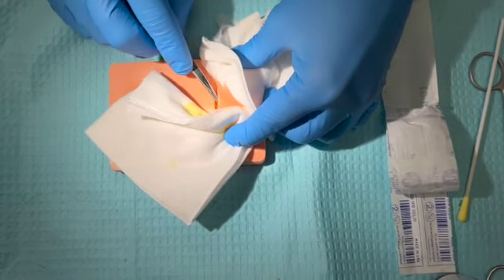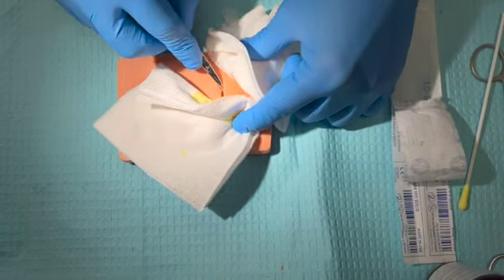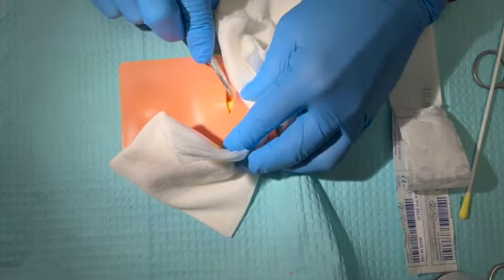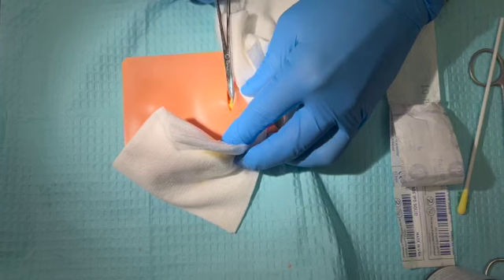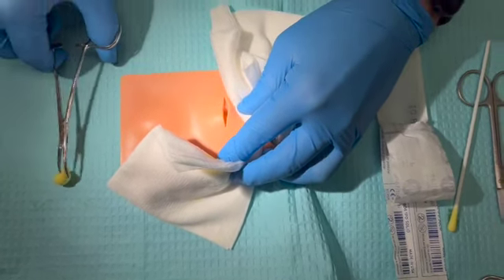We don't want to put our fingers in there for concern of potential sharp foreign objects that may be in relation to this. We can see in this cyst there appears to be a wall similar to a sebaceous cyst. What we can do with our curved hemostats is to try to grasp areas of that wall to break that out, and in this case we can bring it out in its entirety.